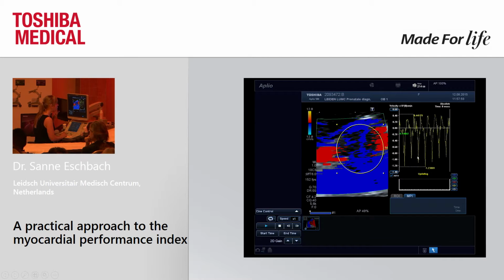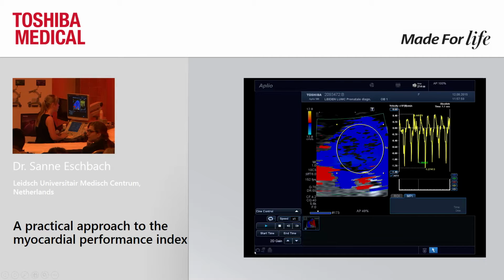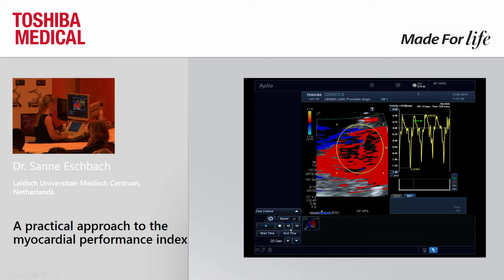Because the heart is younger, I can see it very well. I define again one cardiac cycle to examine. Well, let's just take the middle one. Start time. Here we see the contraction time. Here we see the relaxation time. Oops. End time.